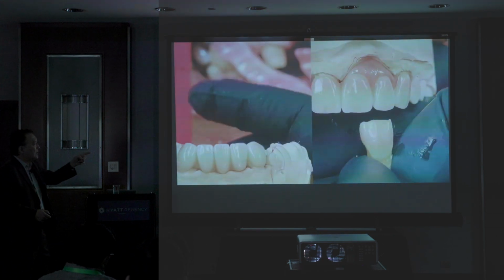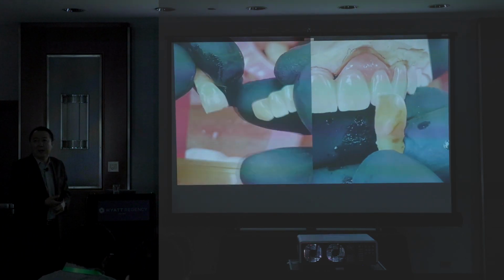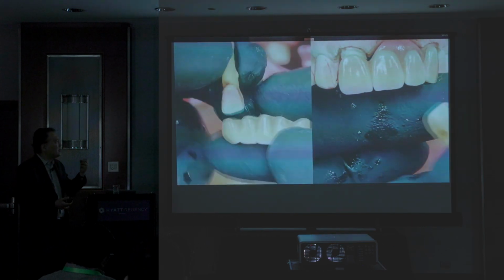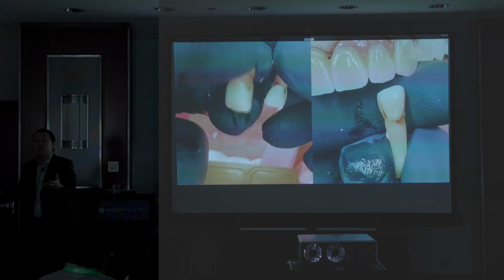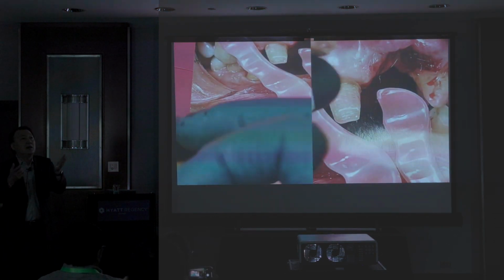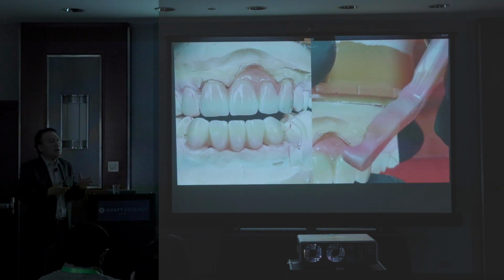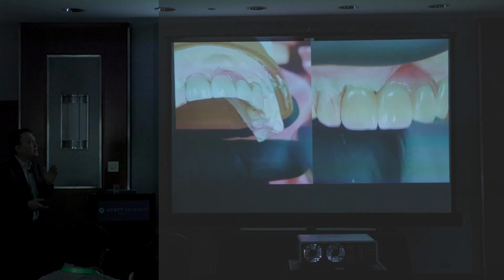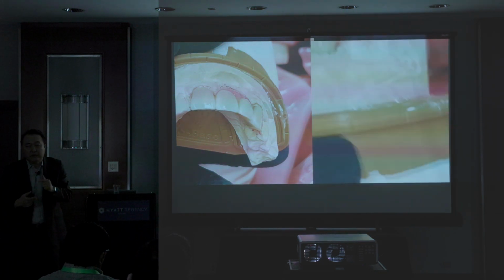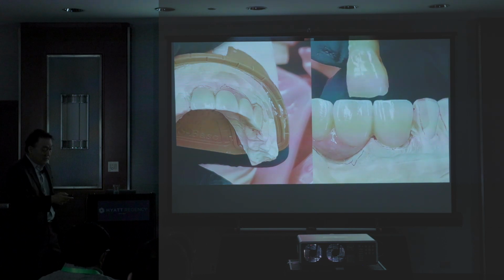Anyway, it's lower, we fabricate too. With the enamel, the body. So we cut back a little bit more. Do I need a lot of room? No. I just need a minimum cut back, 5/10 or 3/10 millimeter, that's about it. I don't need a lot of room. So my technician gave it to me with 1 millimeter, 2 millimeter room. I don't need it unless it's a super elderly patient who drank a lot of wine. Then I see a lot of grayish and pinkish color, and the low value, then possibly I need more cut back. Until then, I don't need more cut back, because like I said, back to the beginning, I like the value. Value meaning I have to block the natural teeth as much as possible. Then I can create the facial area.